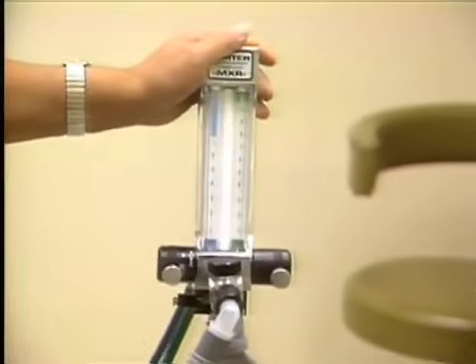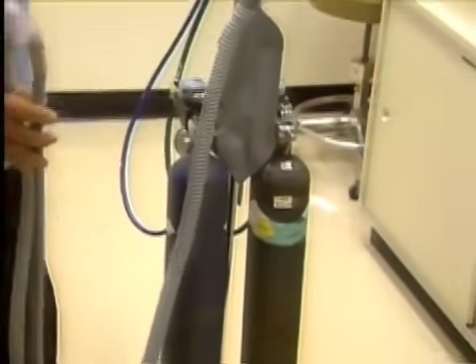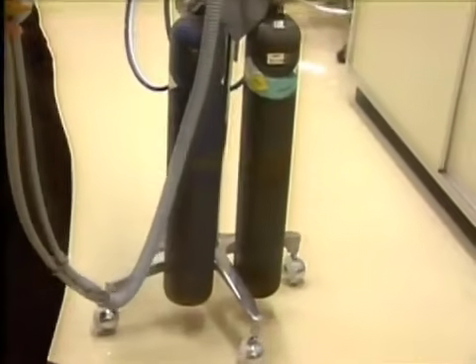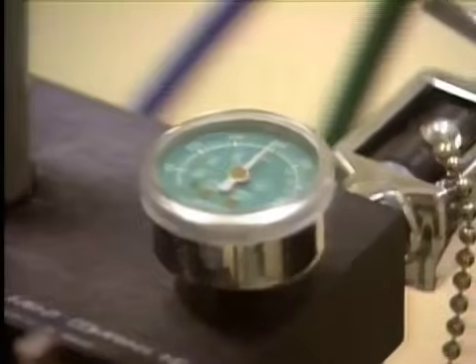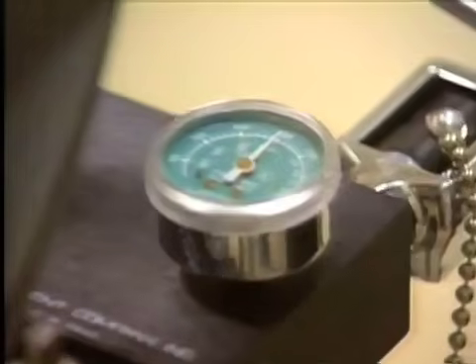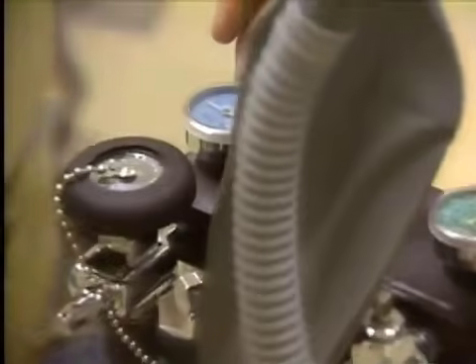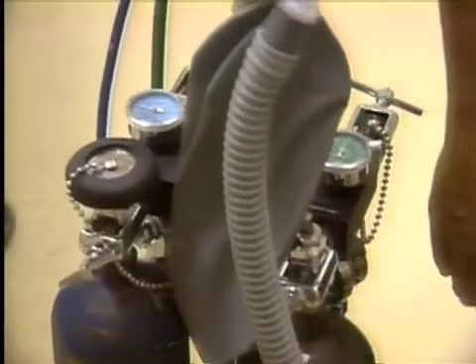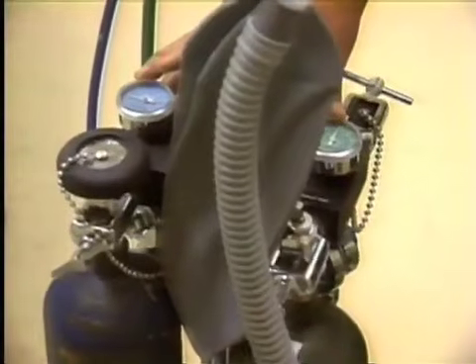Rooms without a wall mount unit can be supplied with a portable unit. The portable unit is the same unit as the wall mount. It will have a nose piece, the tubing, the rebreathing bag, as well as an oxygen and nitrous oxide monitor. These units will have their own gases, the oxygen as well as the nitrous oxide, and these gauges demonstrated here demonstrate the amount of oxygen as well as nitrous oxide in the reserve in these tanks. These gauges must register above 0.